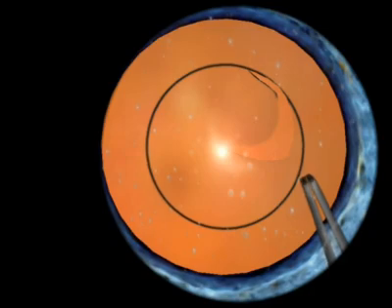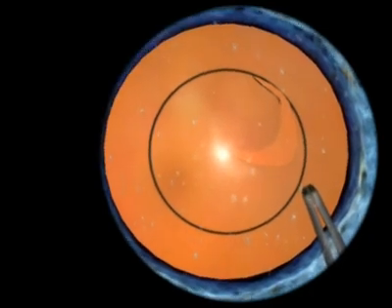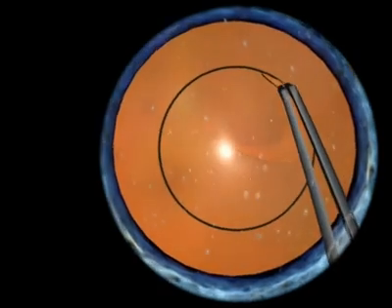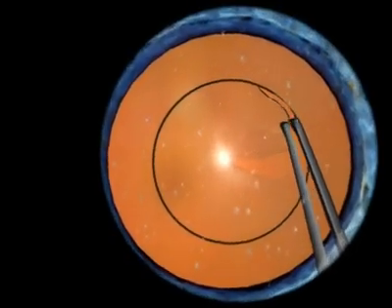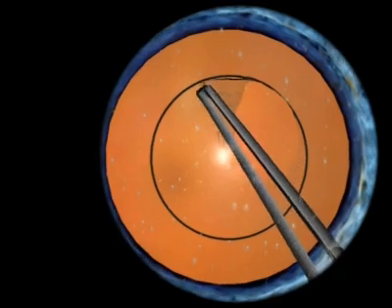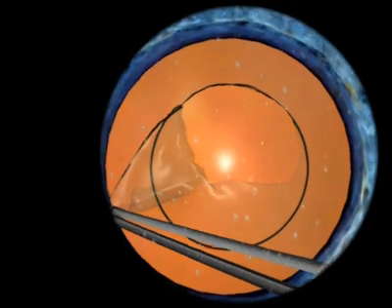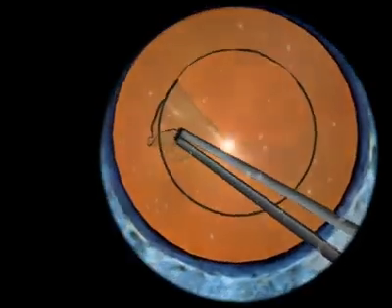Here the forceps is coming in, and you can see that we've got a tear that's already begun and a black line, which will be our guide as we make this Rhexis. I've been able to grab the initial tear and I'm trying to bring it around so it just follows the black line of the Rhexis guide.